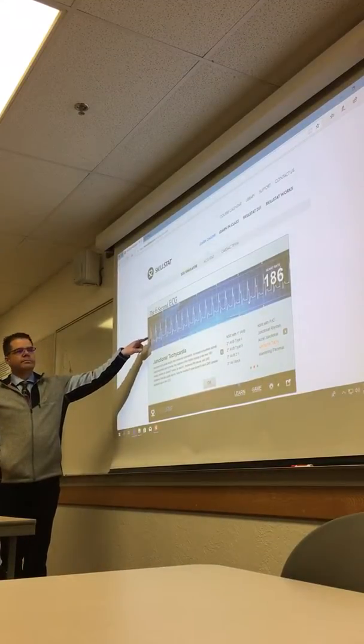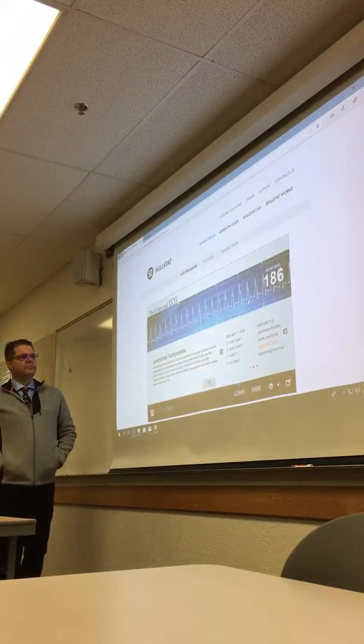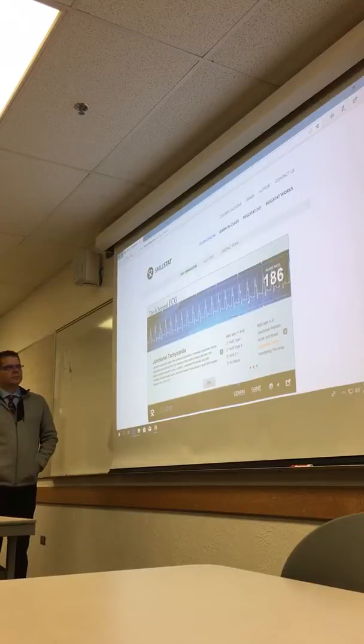So with the junctional tachycardia, it doesn't usually look like that, is what you're saying? It would usually have a narrow QRS. This one looks notched, and it looks like it has a little P wave. It's really just the beginning of your QRS.